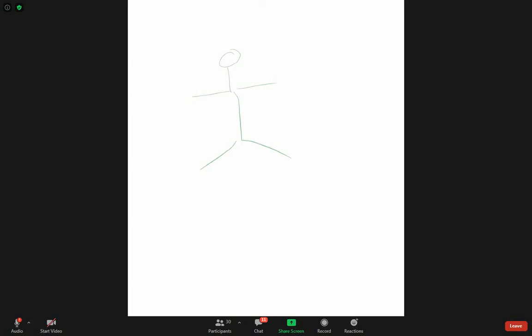We have 4 electrodes: one on the left arm, on the distal forearm, also the right arm, and then a left foot and a right foot. Here is the heart.